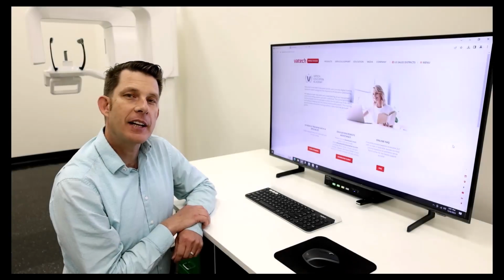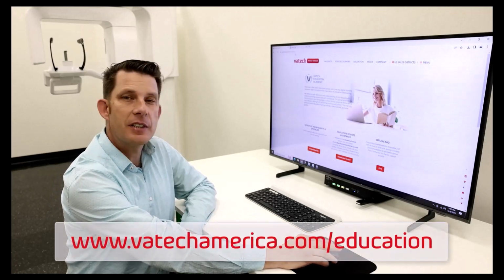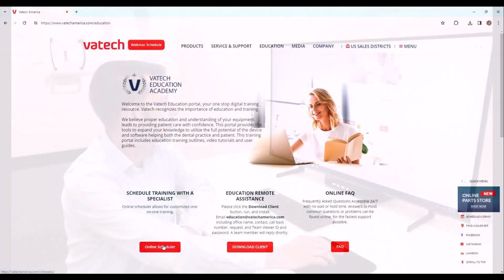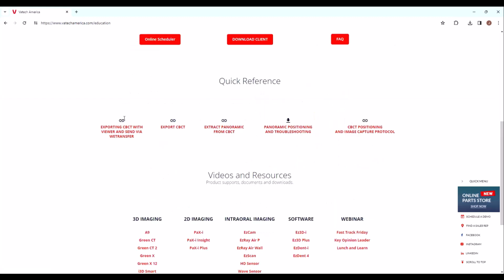Here we are at our Vatech Education Academy. We are at vatechamerica.com/education. Let's look at some of the content within the Academy portal. Here you will find options to connect with a training specialist, launching our team viewer, or FAQ area for frequently asked questions. The quick reference area provides short training modules answering the most common questions that we receive.